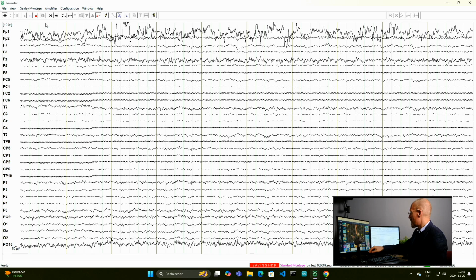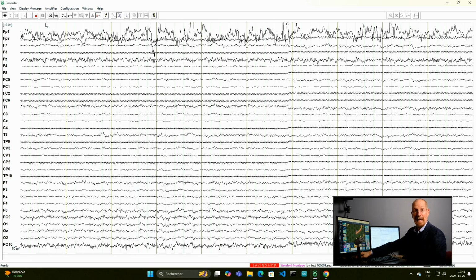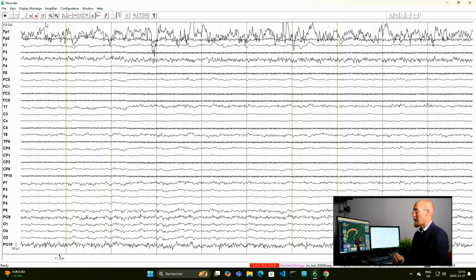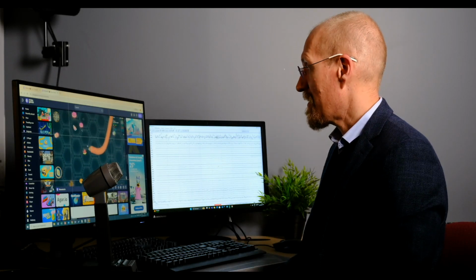So I'm going to wait until the signal comes around again. I'm going to mark my end marker. So there's my task 1 end marker. That'll let me know that that's when I need to stop my analysis for the first task.